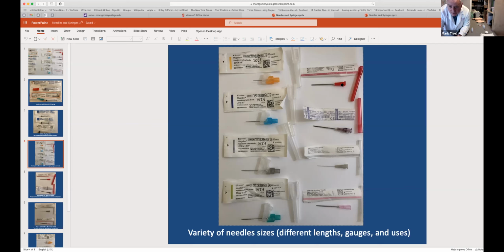Now, important mark here for the blunt is there's a two-step to drawing up an intramuscular medication from the vial. You use the red blunt for starters. This is how we do one thing and one thing only: draw the medication from the vial. Then in step two, we will convert to our injector needle.